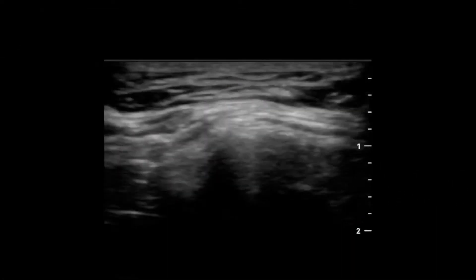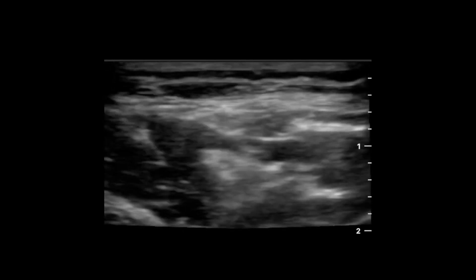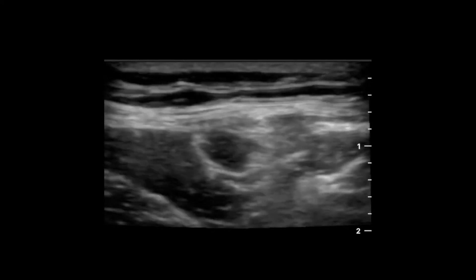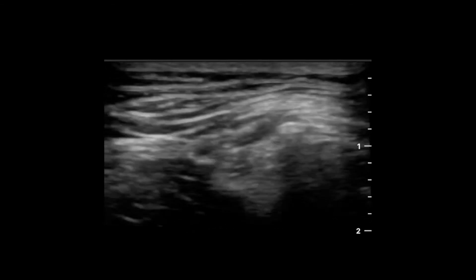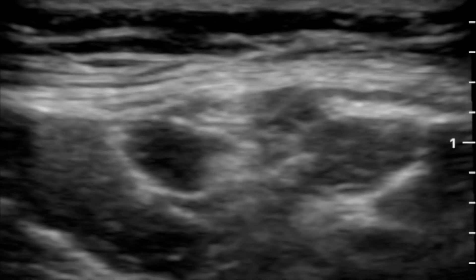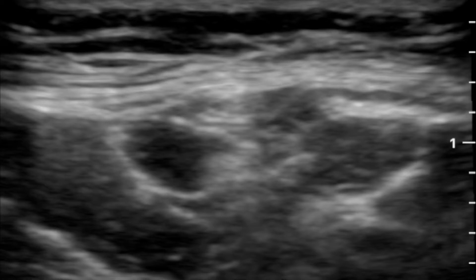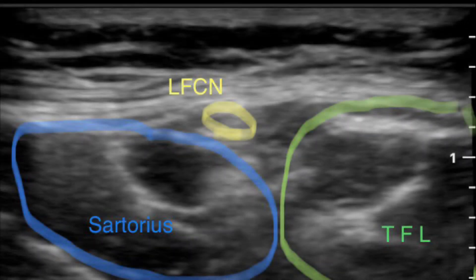From this position, as you do a short axis linear slide distally, you will note two muscles arising from where the ASIS was. On the left side of the screen — which is more medial — is a large, relatively triangular muscle in cross section: that is the sartorius. To the right is a muscle that is more round and oblong in shape: that is the tensor fascia latae. In between those two muscles you will find the coalescence of the fascia latae and the fascia iliaca, and in that crisscross transition zone you can look for a short axis image of the lateral femoral cutaneous nerve.